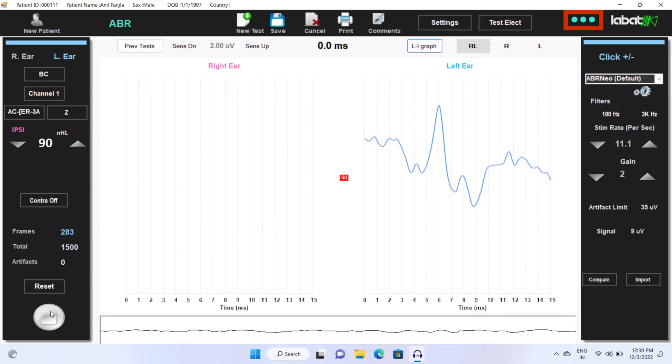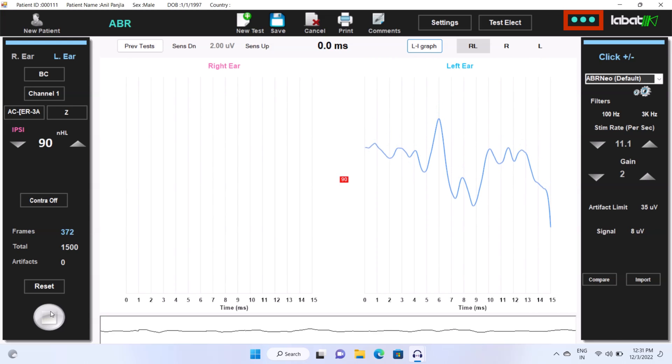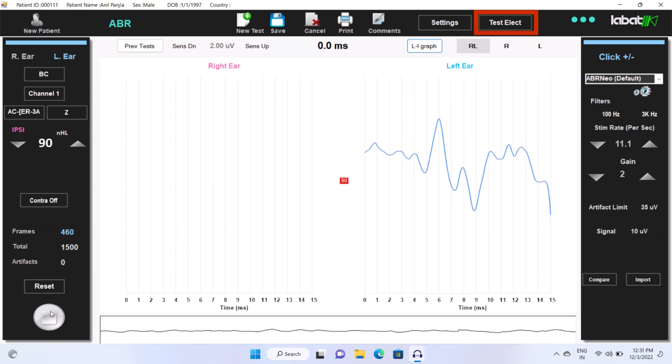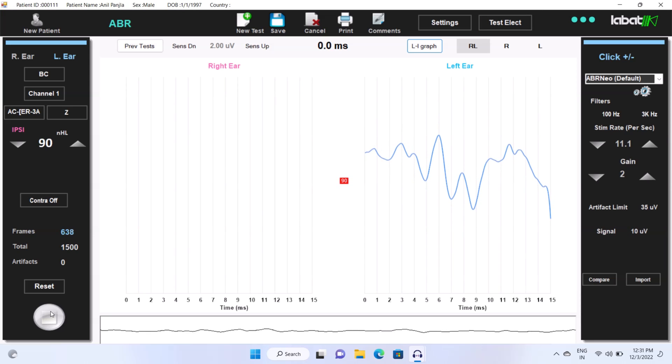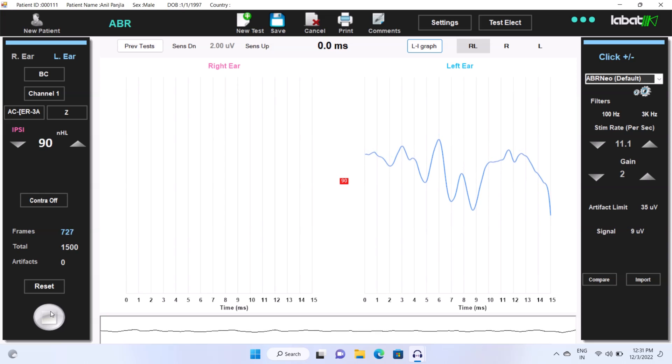These indications show that your device is properly connected. Test electrode is used to see the electrode placements. Wait till up to 1500 frames.